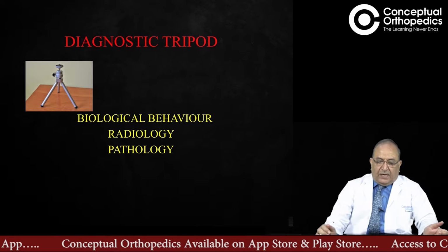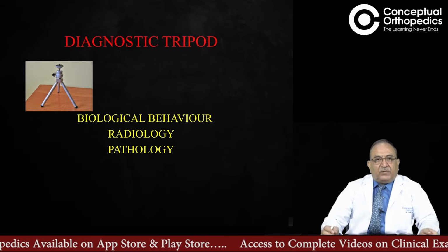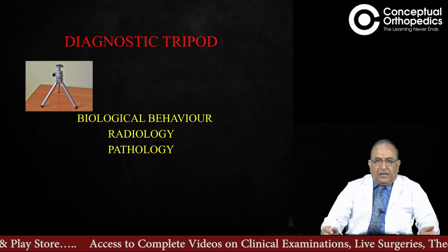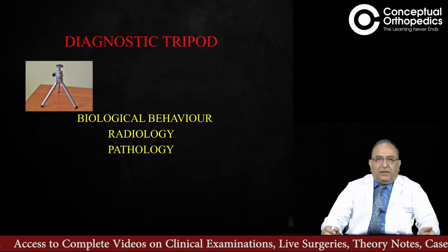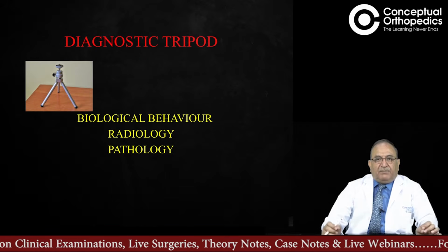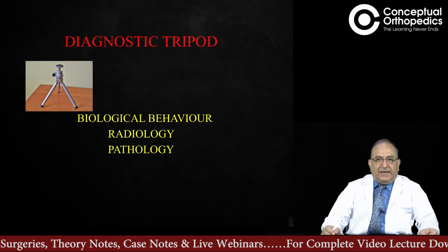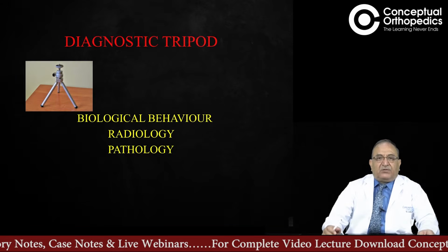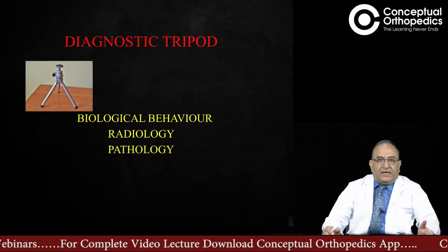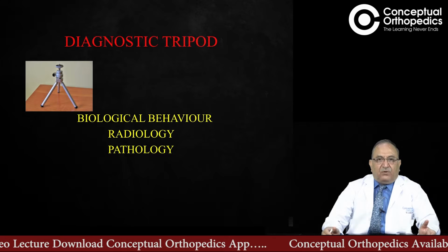And I would also like to highlight the importance of plain X-rays in the diagnosis of bone and joint tumors. You see, though there are multiple investigations available like CT, MRI, PET scan, they are all important. But for the diagnosis of bone tumor, the best investigation still is a plain X-ray because it has characteristic findings. For further evaluation or staging of a tumor, more investigations will be required to find out the grade and stage of a tumor. So one must be very conversant with the plain X-rays of bone tumors.